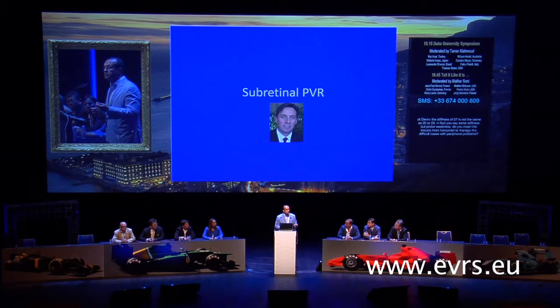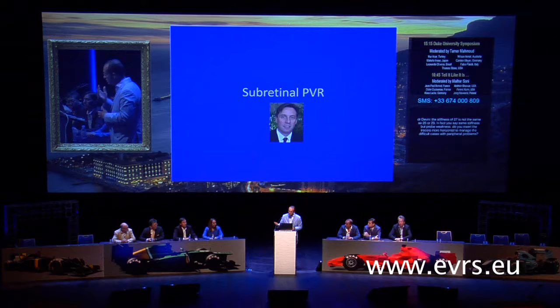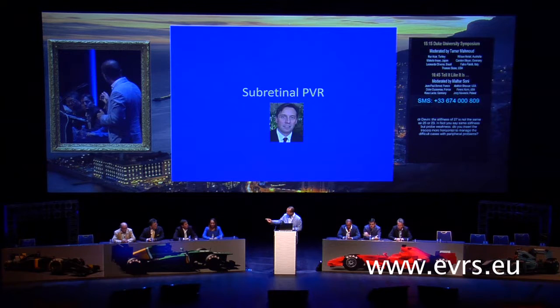So if you're a retina surgeon and you're used to put a gas bubble or even air in the eye, if you use a type of intraocular lens that is hydrophilic and you use any air, even a small air bubble that is in contact with the lens, you will get in those cases, even in a few months, calcification of the lens. So whatever you use is very important. Most of the lenses we use are hydrophobic, but it's very important to know those hydrophilic lenses, and in most of those cases it's already complicated, so you may expect that you may need an air or a gas bubble in the eye. So we're going to keep moving and go for subretinal PVR.